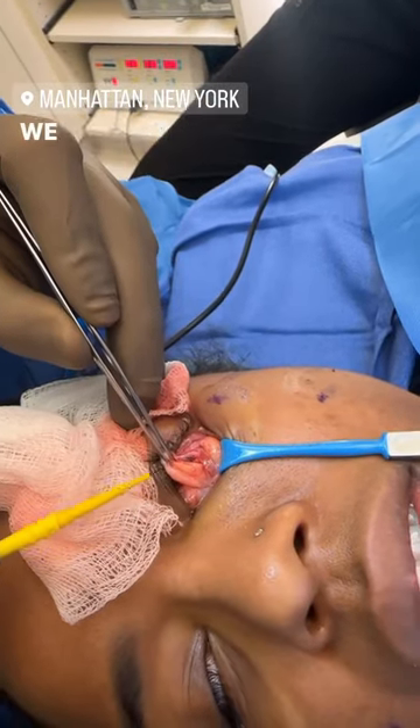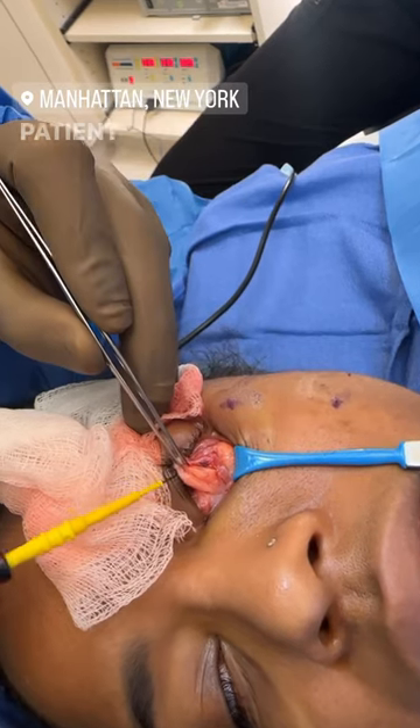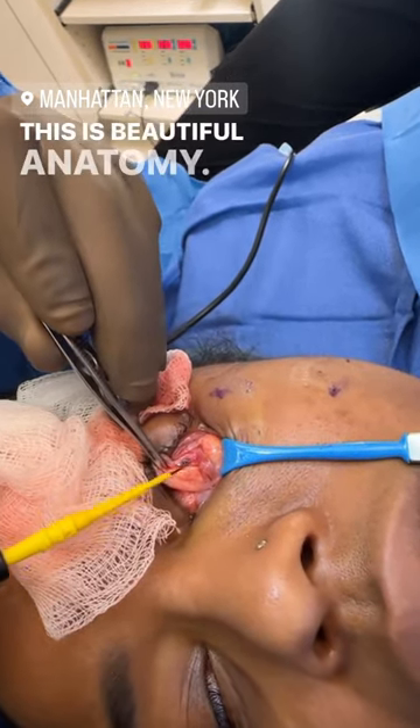We are done with our buccal fat. We started our lower blepharoplasty using a transconjunctival incision. The patient is awake yet comfortable. This is beautiful anatomy.